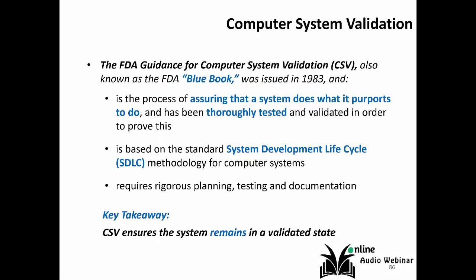Now, we talked about software as a medical device, having AI and ML capability in it. And then there's software in a medical device, where the software is running in conjunction with a piece of hardware. But then there are also software products that are used for systems that support medical device manufacturing. And so the FDA came out with their guidance on validation of these FDA-regulated systems in 1983, over 40 years ago.